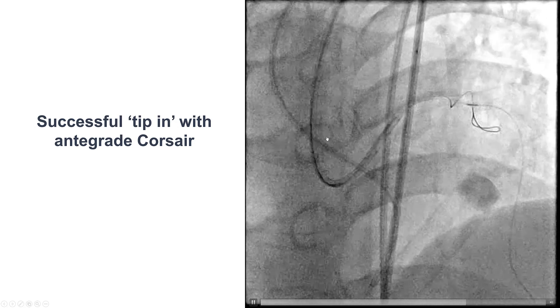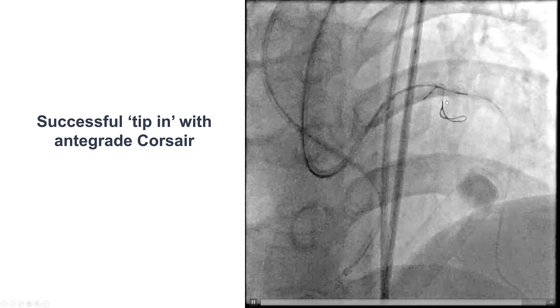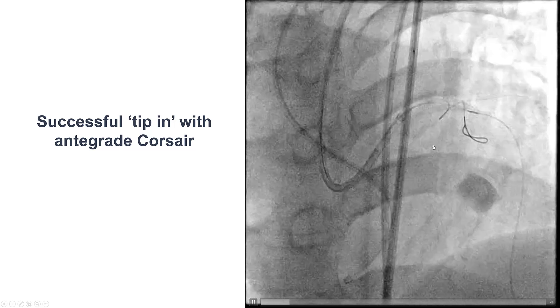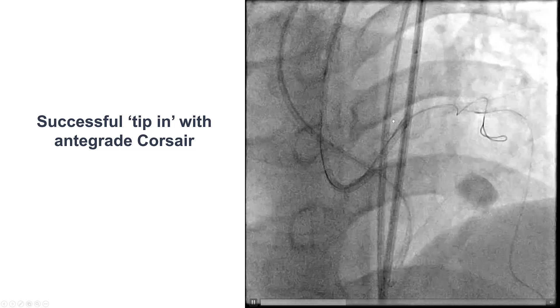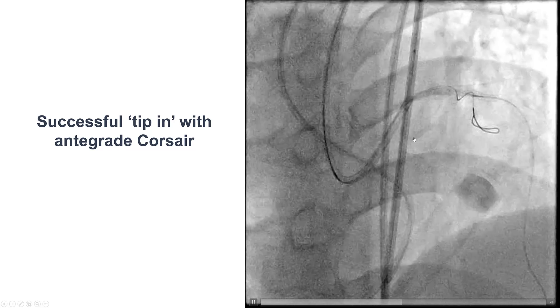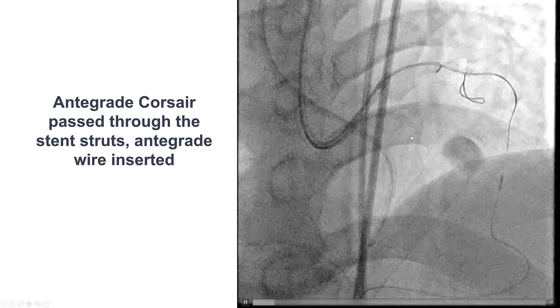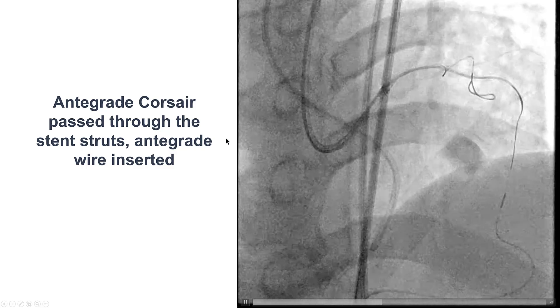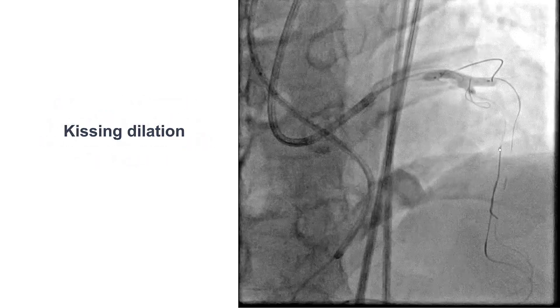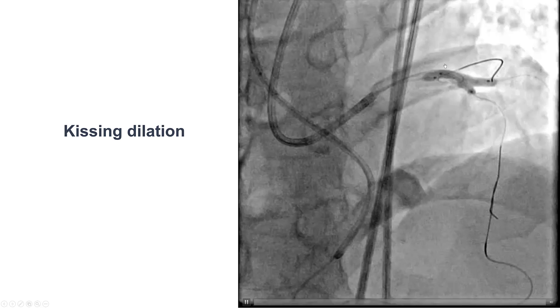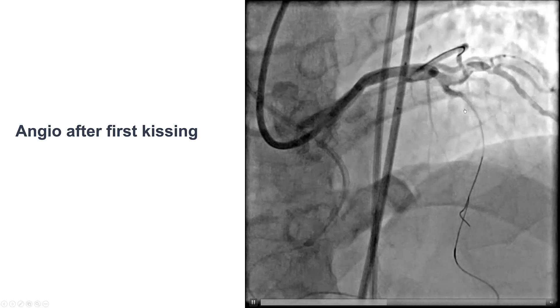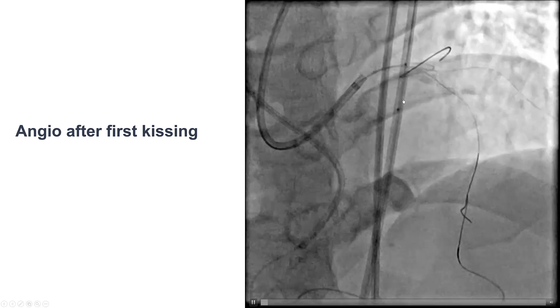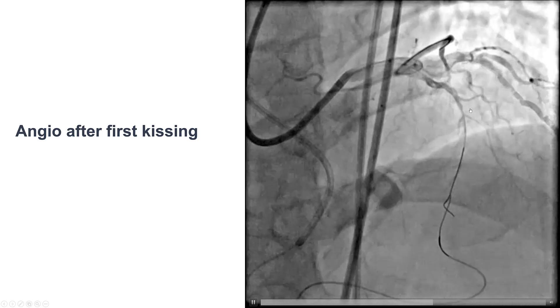We did not want to externalize this wire because we knew we would have to remove it again. So we used the tip-in technique, in which we advanced a Corsair microcatheter over the retrograde wire and advanced it all the way inside the proximal LAD. After doing that we had access into the LAD, inserted the standard workhorse guidewire, and performed the first kissing balloon dilatation. There is some stent underexpansion and calcium in the proximal portion of the LAD. The angiogram after the first kissing shows some area of dissection but antegrade flow into the LAD, which is a very diffusely diseased vessel.